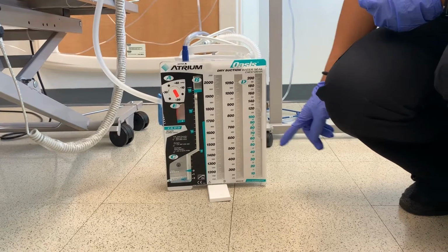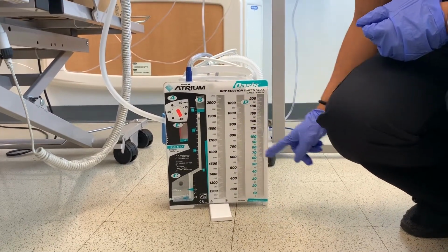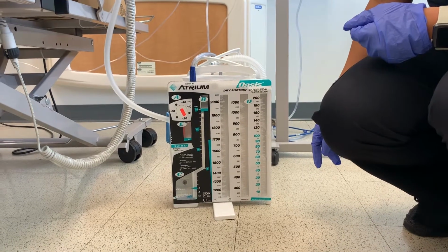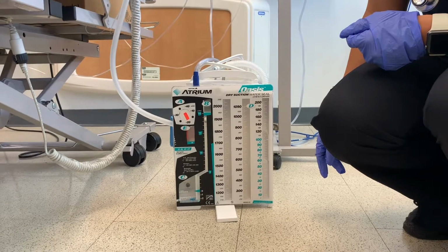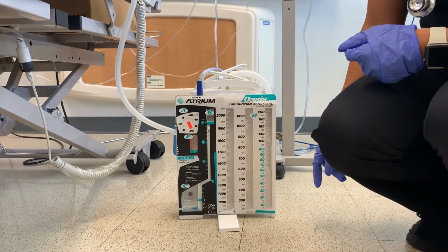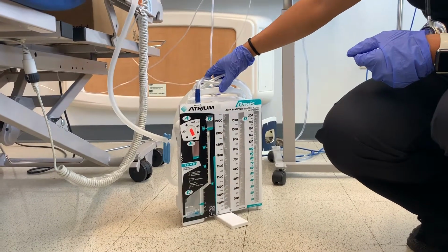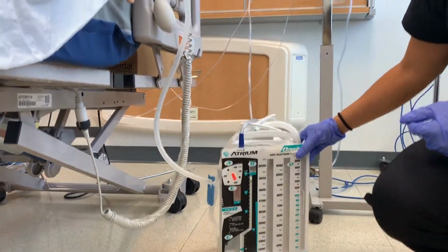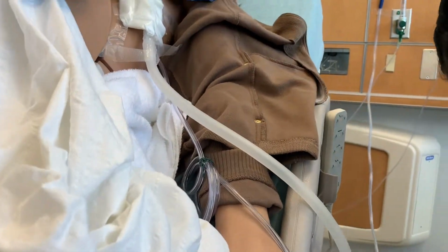Assess the drainage by inspecting the collection container at least every 15 minutes during the first 2 hours after the chest tube is inserted. Check every 2 hours thereafter. Watch for dislodgement of the tubes and remedy the problem promptly.